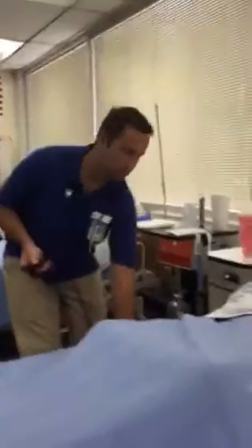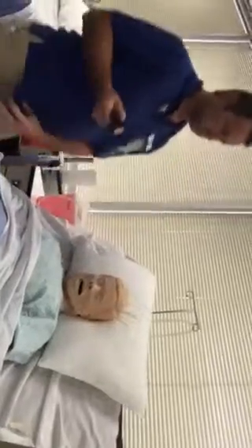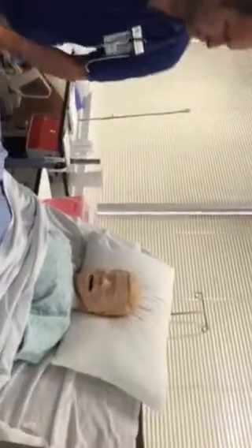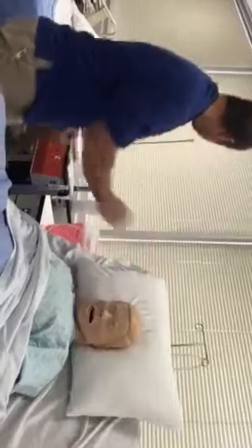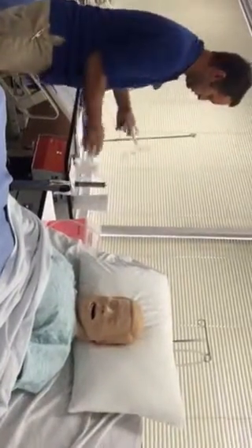Very good, very good. Okay, so what we're going to do is move him into the high Fowler's position. So we're moving in high Fowler's position. I'm going to take our NG tube.